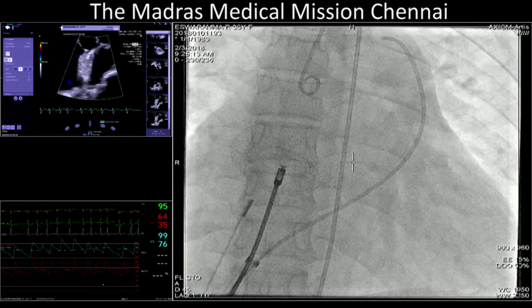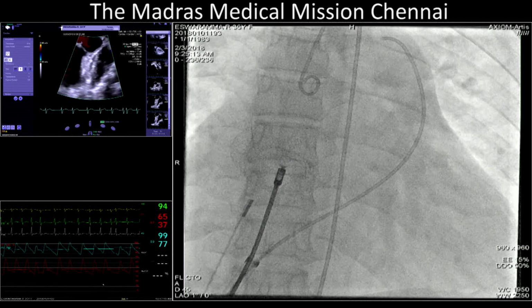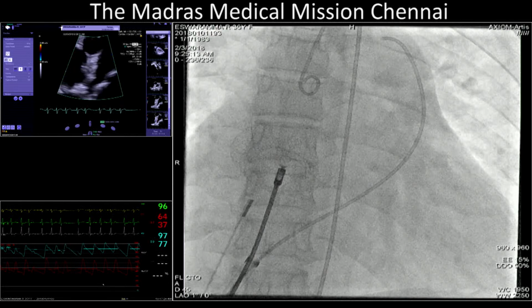Sedation with ketamine 30 and midazolam 2. So shall we leave you at the moment? About 15 minutes later, I will show you an intracardiac echo picture with a larger femoral sheath. All right, we'll come back and get an update.